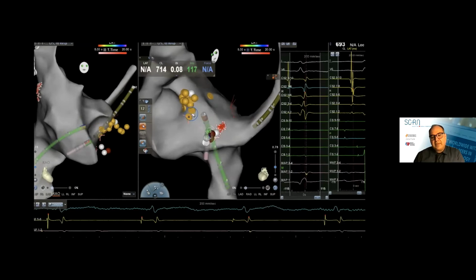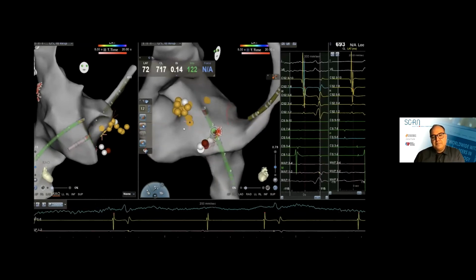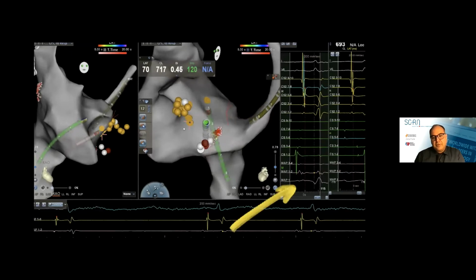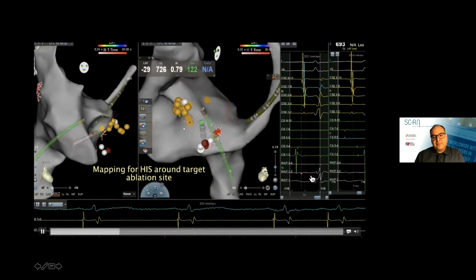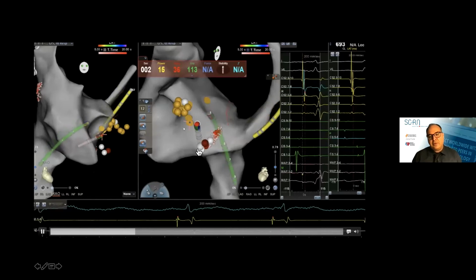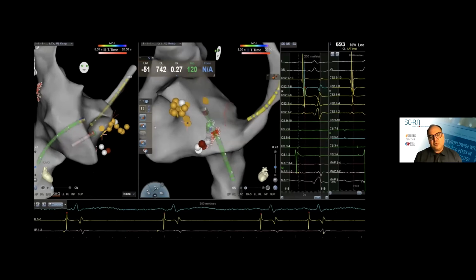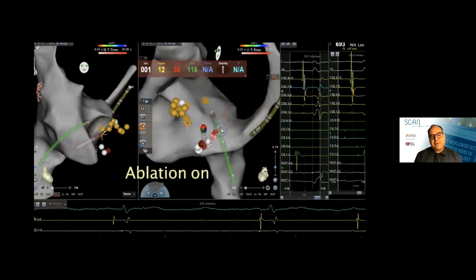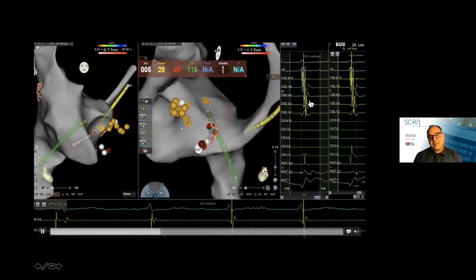And gradually moving the catheter cranially. No His there. Even there's no His, and that's ventricular. So we're clear in this area. So very clearly, you're sitting next to the monitor. You can look at it yourself. You can move the catheter, be sure that the catheter is stable. And then when it's stable, I came on ablation here, and you see the patient went to junctional.